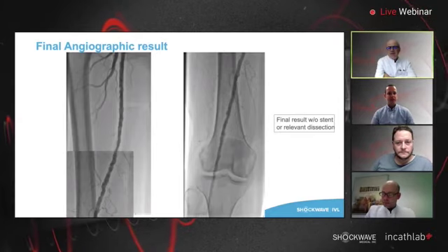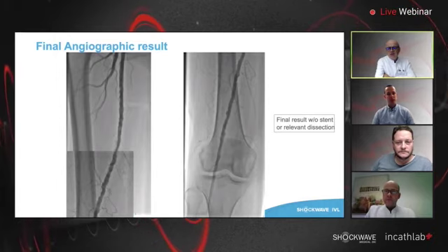Well, in general, and that's true for every kind of balloon-based procedure, what we learned in the last couple of years is basically that you should not be too conservative in balloon sizing. That's true for IVL, that's true for drug-coated balloon angioplasty. Undersizing does result in recoil. It does even result in more frequent dissections.